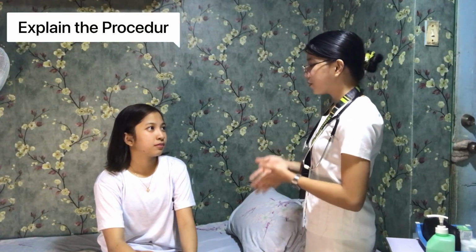Okay, thank you, ma'am. Is it okay with you if I take your vital signs? It's okay. May I know how you are feeling for today? I'm fine. I just want to know the state of my body. Okay po. For today, I'll be checking your vital signs. Your vital signs are crucial for us to know if you're having troubles with your health or if you're in perfect health. The vital signs consist of four factors, which are body temperature, pulse rate, respiration rate, and blood pressure.